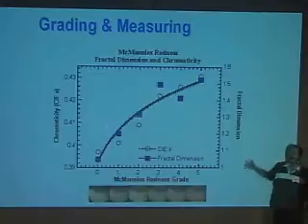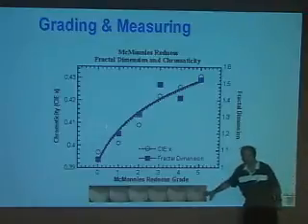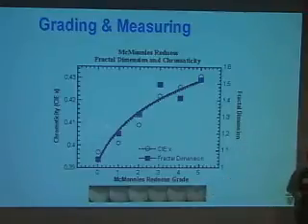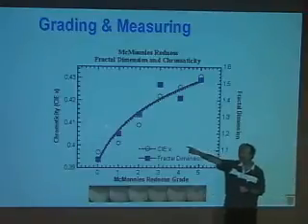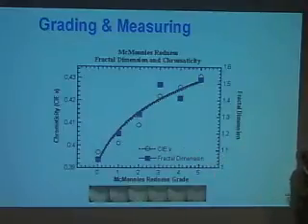And then something over here is fractal dimension. In this instance it was a box counting fractal dimension way of just characterizing the vessels. So we select a region of interest that corresponded approximately to where we measured the chromaticity. So the chromaticity is not really measured with image processing, it's measured with a photometric device. Take something, aim it in the area that's red.